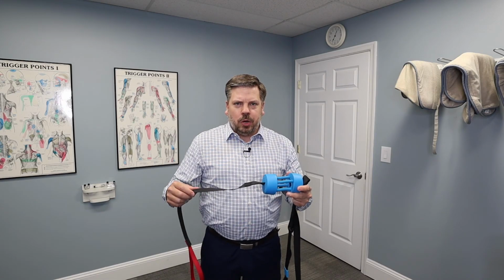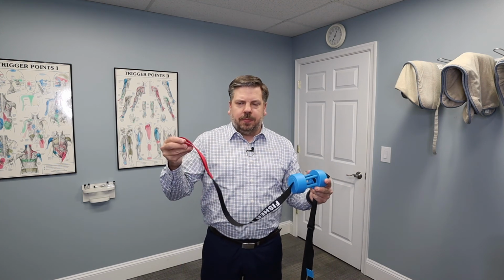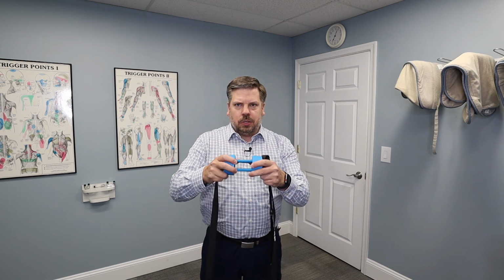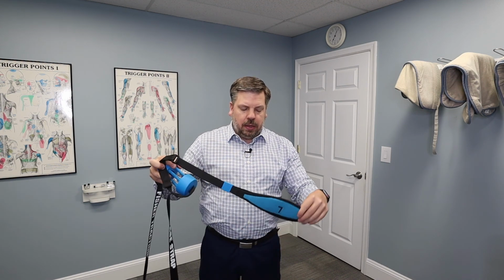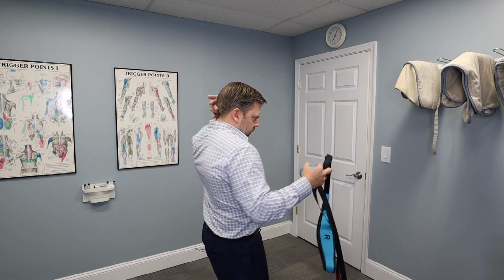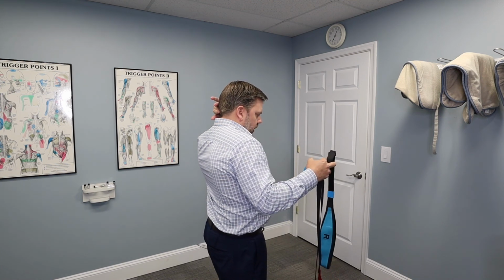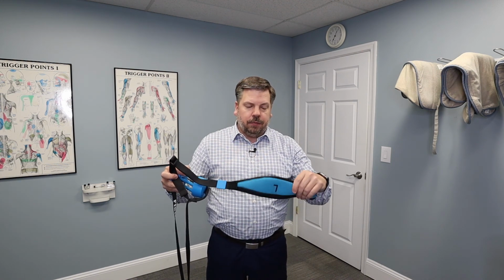Now here is the Fisher traction unit for the neck region. So same kind of principle. You're going to have this part that's going to loop around the door handle and then secure in the door. This is the portion that's going to apply the actual traction for your neck. The difference is on this one, we have a harness that's going to go around the base of your neck, and it's going to be applied right around this area, right below the occiput, right between the upper neck and occiput area there. That's going to secure there. There's a left and a right.